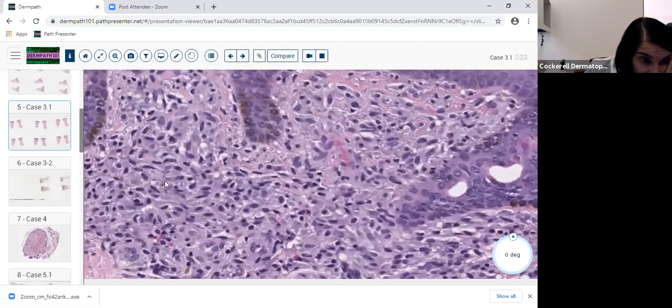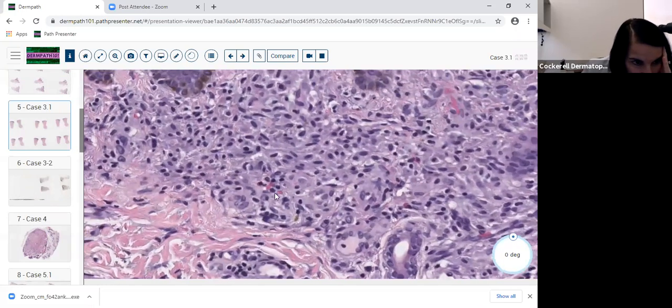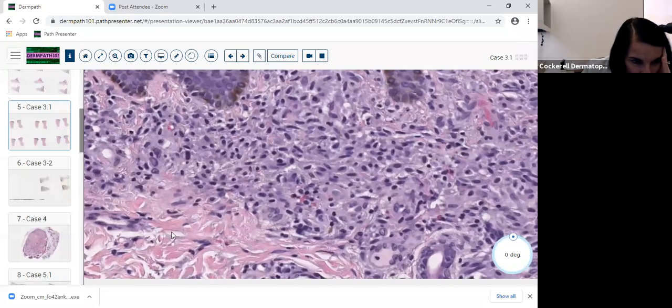What I have is a ton of cytoplasm, and the cytoplasm is amphophilic, meaning it picks up basic and acidic dyes. So it's picking up a little bit of the eosin and a little bit of the hematoxylin. That's how I think of it. So its color is between the color of these cells and the eosin down here. So can you visualize what amphophilic is? It's in between these two colors. And sometimes it's moving a little bit toward the basophilic. You know, color is a hard thing. It is a subjective thing.